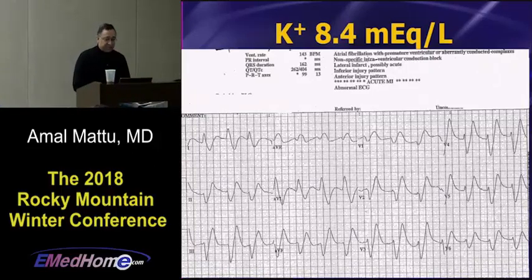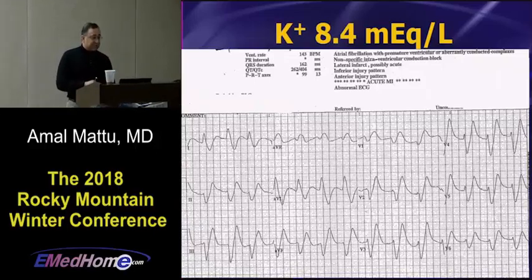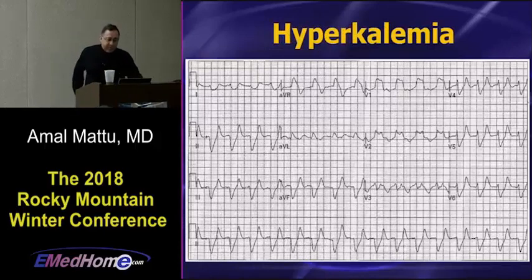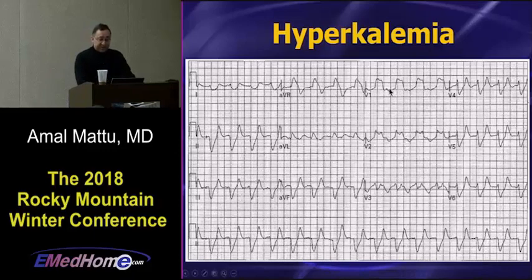So much for computer interpretations, right? Nobody would miss this. There's ST elevation in V1, V2, in multiple leads, maybe 3, and there's a rightward axis as well. Take a look at this one. This was initially diagnosed as sinus rhythm with a massive anterior STEMI by the computer and the physician, because it looks like there's sinus rhythm, P waves, with huge ST segment elevation, V1 and V2, but there's rightward axis.